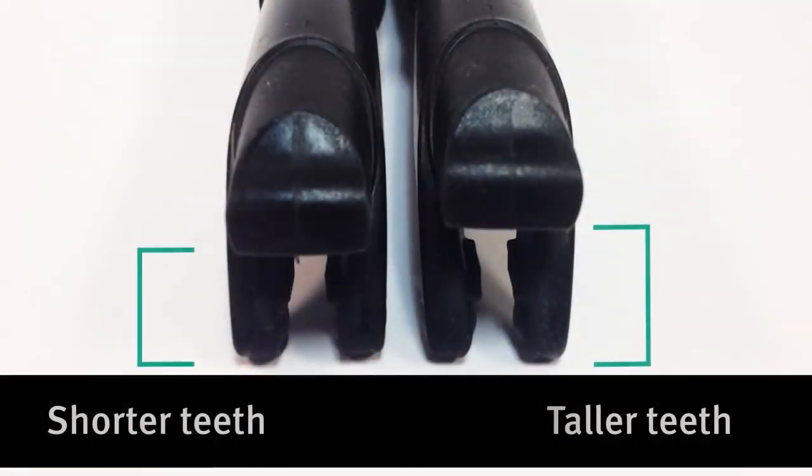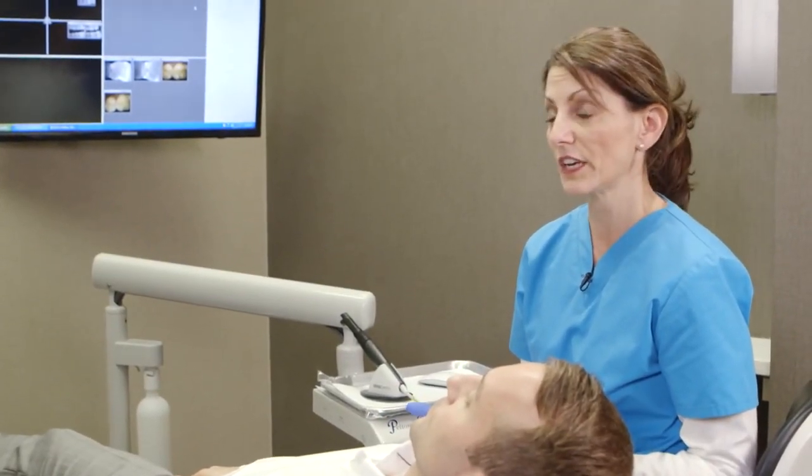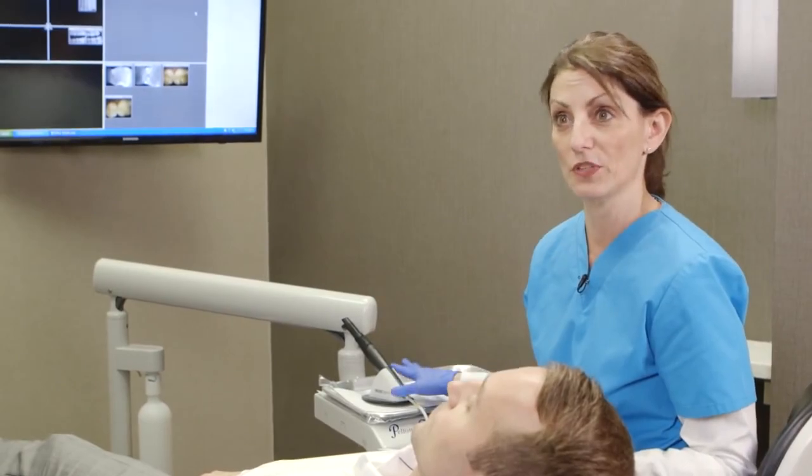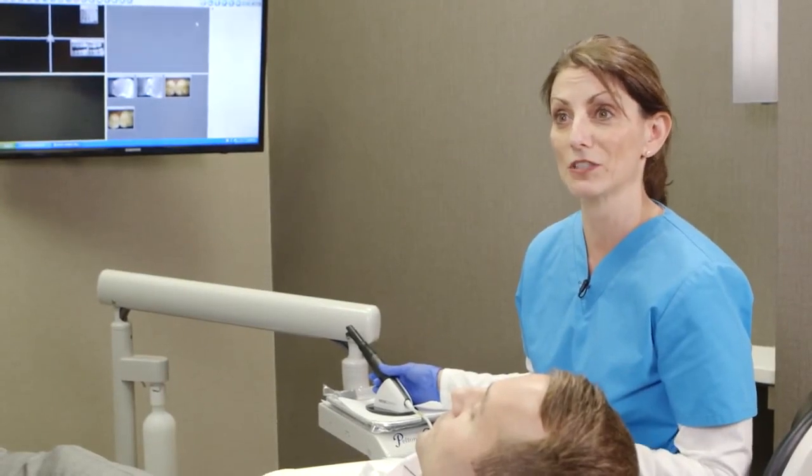Depending on the height of the tooth you could use a small or a large. The best way I've found to use the CareyView is if a patient is experiencing sensitivity, or during my exam if I've seen that there might be a possibility for caries — that's when I really like to pull this out. The patient is experiencing some sensitivity on the upper left, so what I'm going to do today is take an image to show you.